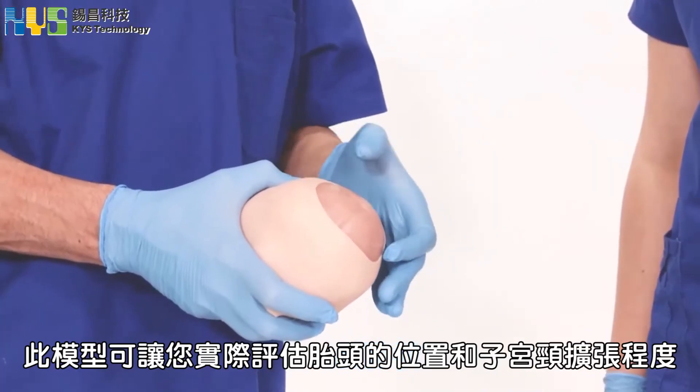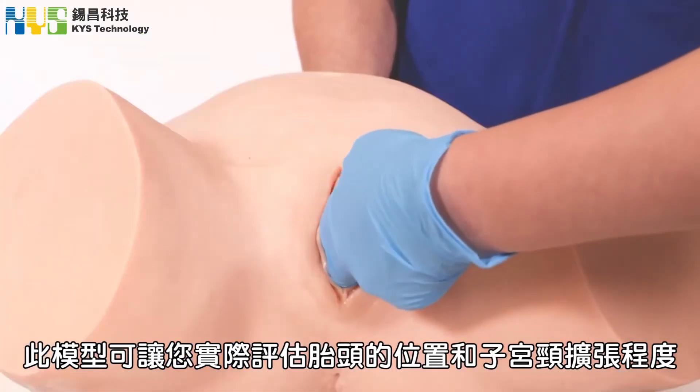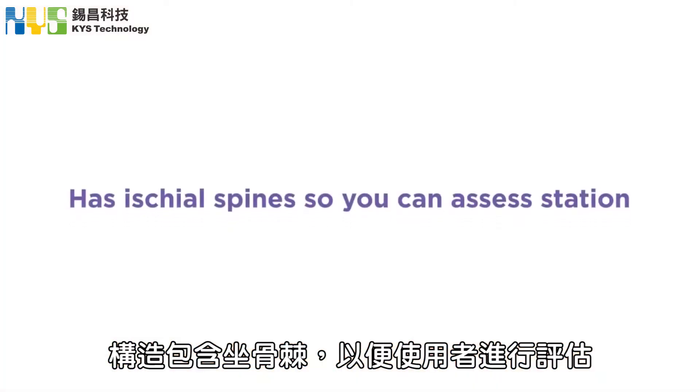The Charlie and Charlie's Mum Obstetric Examination Simulator will allow you to assess the position and station of the fetal head. The simulator has ischial spines so that the practitioner can assess station.